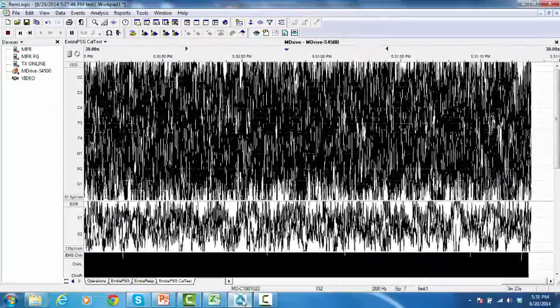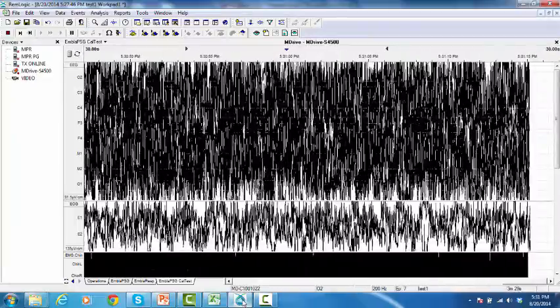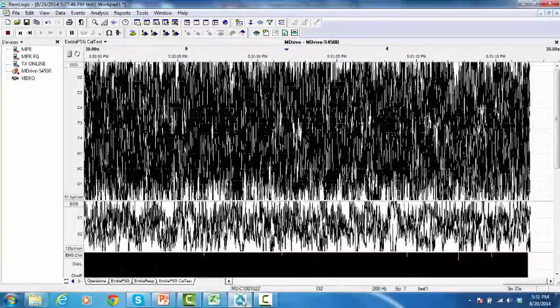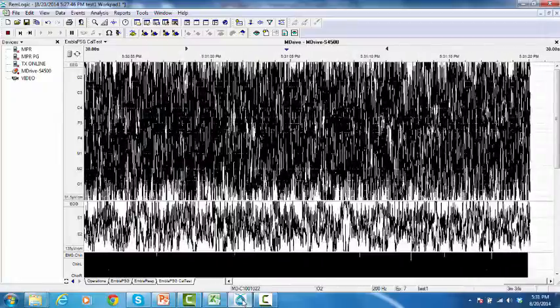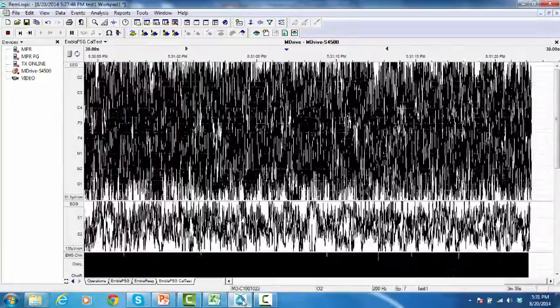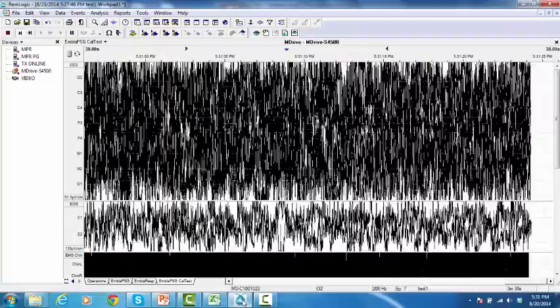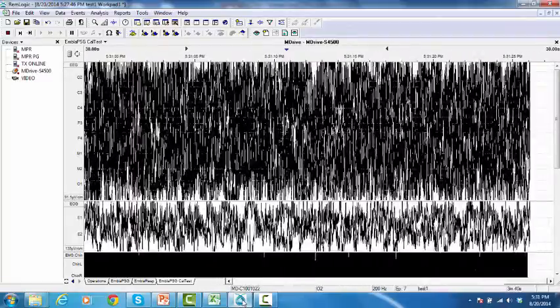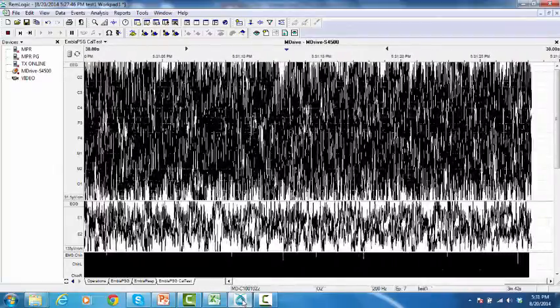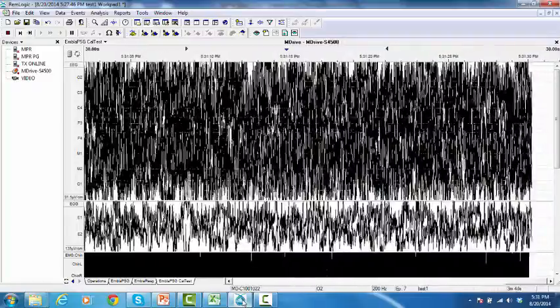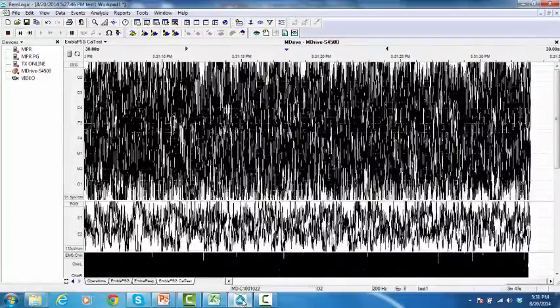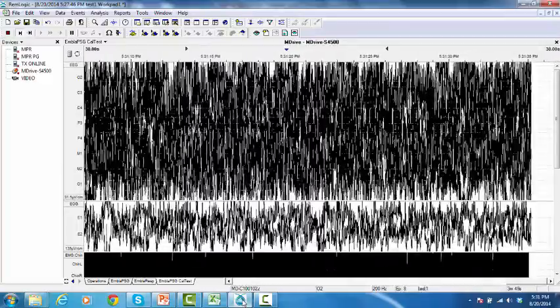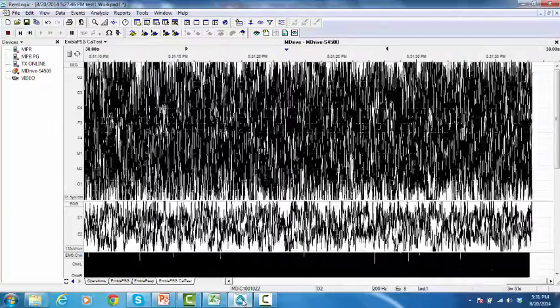In this video, I'm going to demonstrate how to perform the impedance and calibration tests during the recording. An impedance test is an electrical test that evaluates the electrode's connectivity to the patient. Default M-Drive and MPRPG profiles automatically run an impedance test when you start a study.